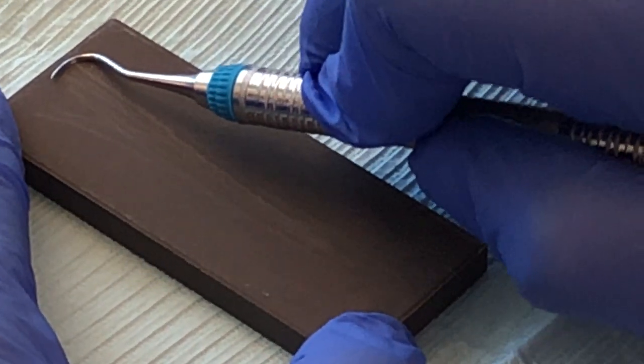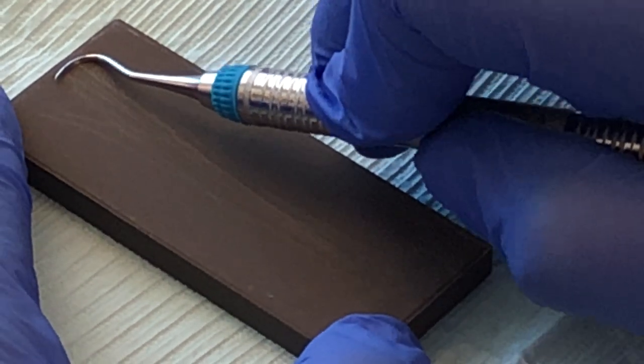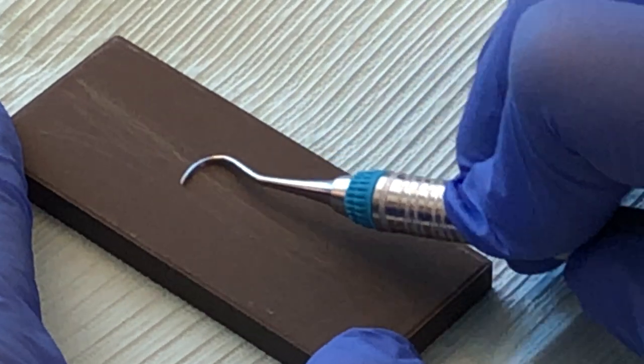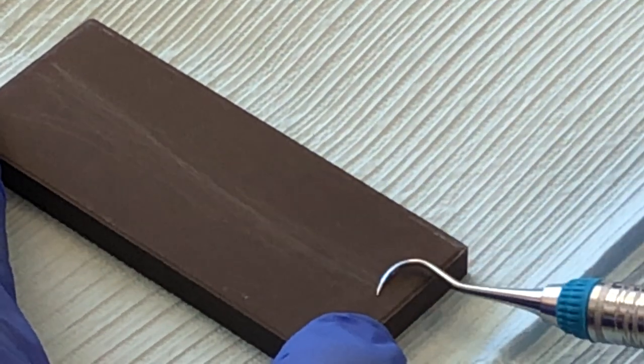Repeat it. Find the spot to grab at 70 to 80 degrees. And bring it smooth and slow and end at the tip.